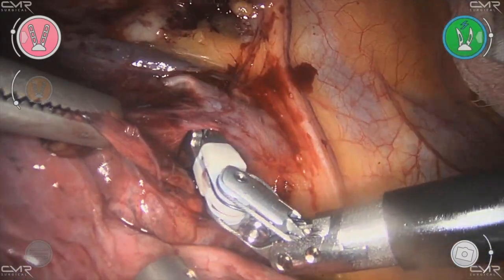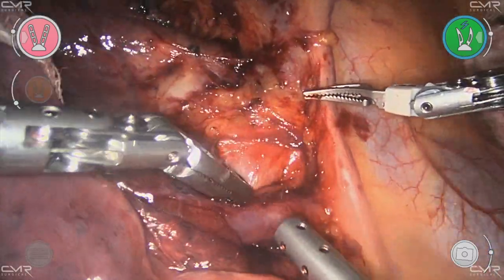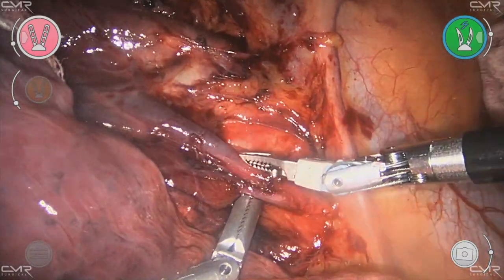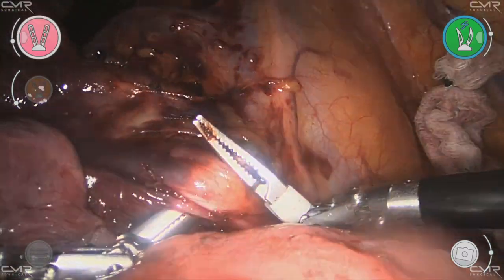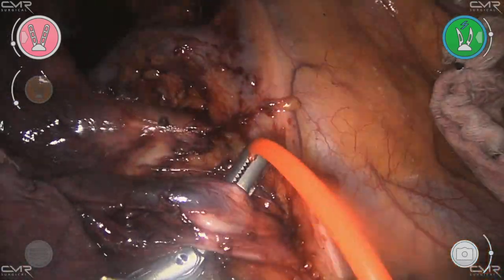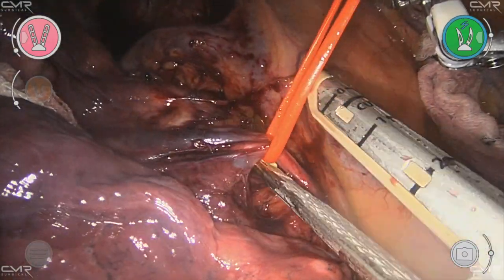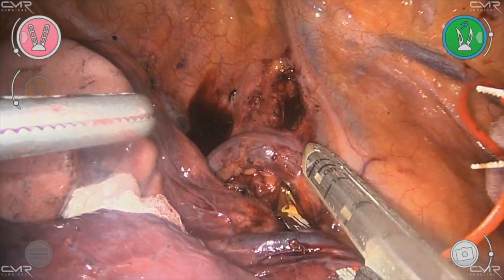We can see the middle lobe vein just below and there's the right upper lobe vein — very easy to see. Starting dissection to get around the upper lobe vein. Really nice stable view with a 30-degree down camera — Versus has either straight or 30-degree down cameras, and most thoracic surgeons use 30 down. Using the Maryland to initially start getting under the vein, getting a nice angle, making that initial space. Then a nice blunt left-hand grasp around the right upper lobe vein, passing a sling. Through the assistant 12-millimeter port we pass a gold-tip tan 30 Covidien and close and fire on the right upper lobe vein.